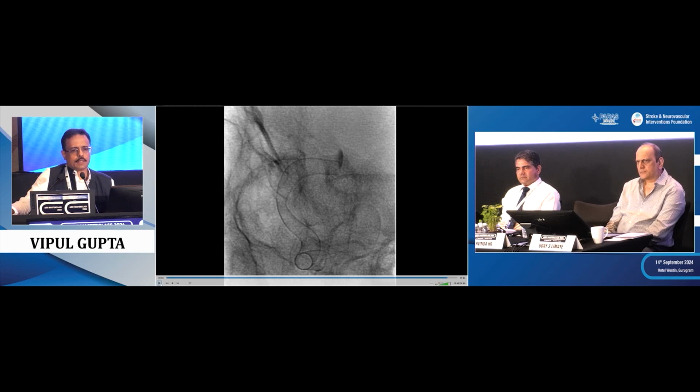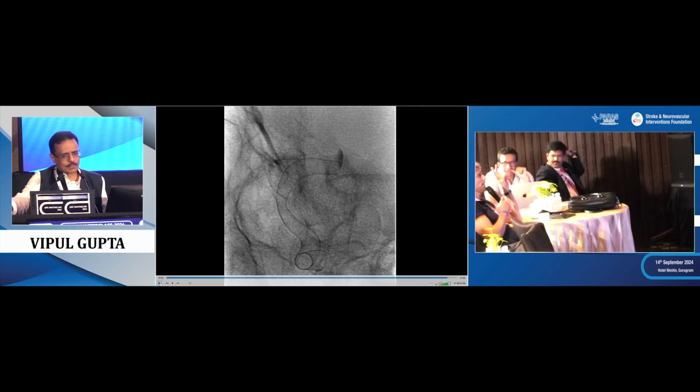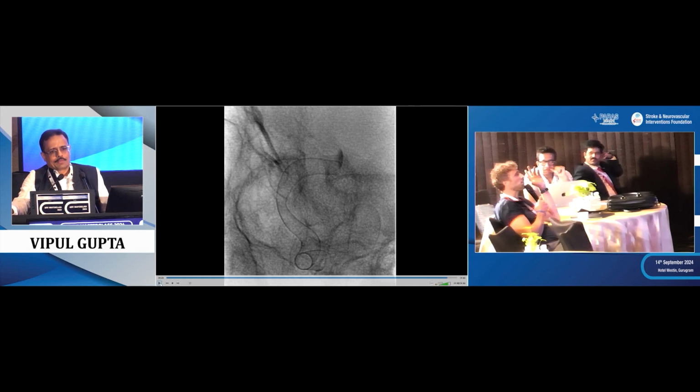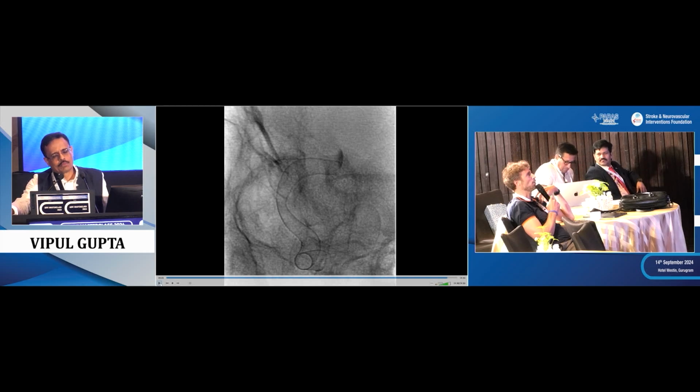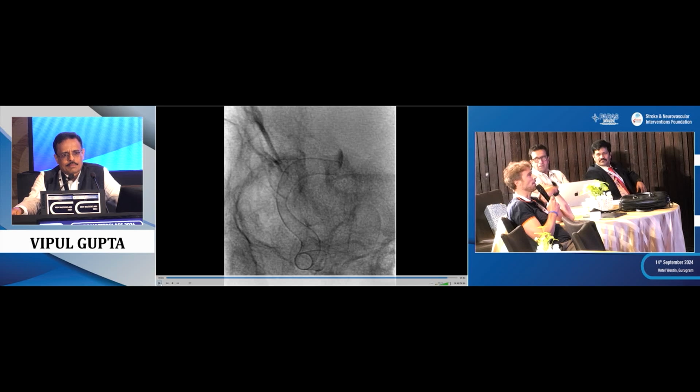So what do you say, Vincent? Solitaire? For the distal emboli, I mean, what more could we do? No, because I think we're in a kind of secondary distal vessel occlusion. I mean, we have no level of evidence that this occlusion that is very distal is harming the patient very much. So I think one solution could be to awake the patient and to evaluate the patient, because you are under double antiplatelet therapy.